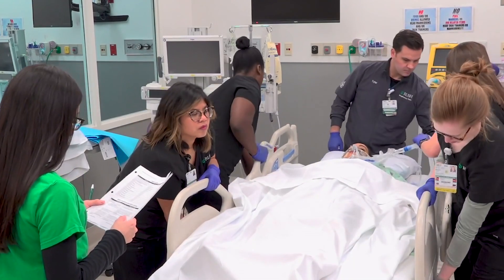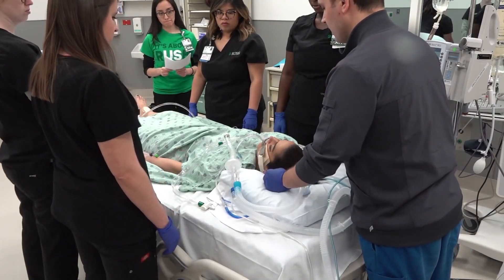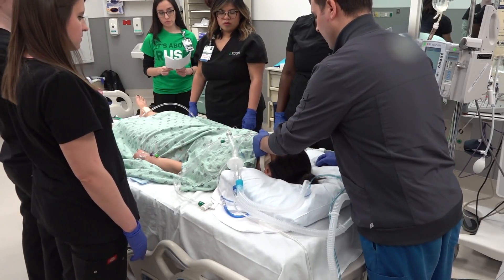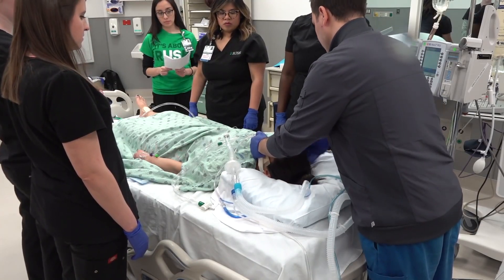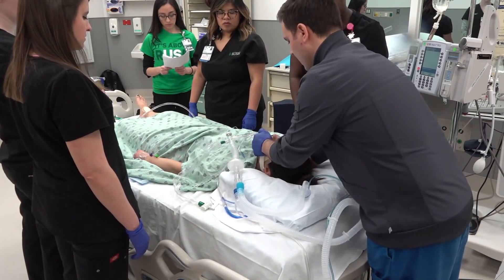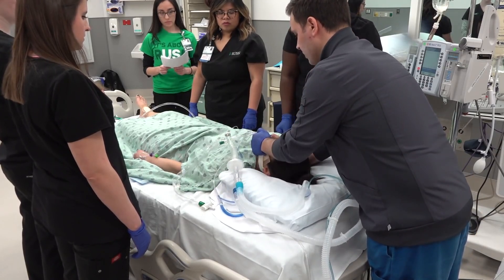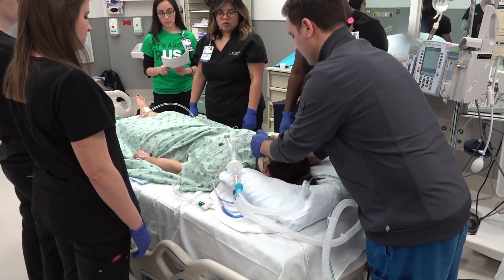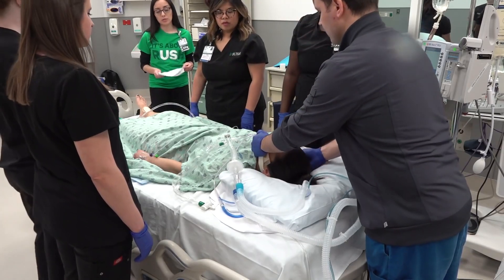The respiratory therapist will now talk about airway management. To reduce the risk of inadvertent extubation, the respiratory therapist should maintain the airway with one hand holding the endotracheal tube along with the mandible, with the other hand placed under the patient's occiput to support the neck. This way, if the patient moves, the hand is moving with the head and the endotracheal tube. From here on out, all movements will be executed on the respiratory therapist's count of three.